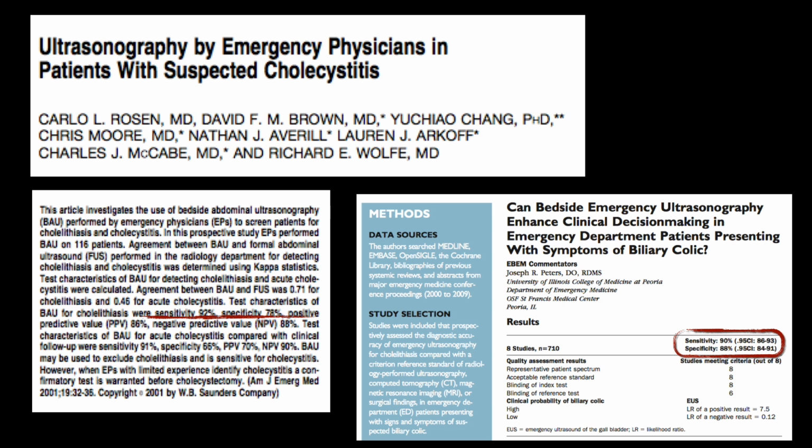And then in an ACEP review that was published many, many years later, there's an aggregate sensitivity of 90% and specificity of 88% for us doing bedside ultrasound, and this is looking for patients with symptomatic biliary colic. As we look at it, these numbers are starting to look very, very similar to the radiology numbers that we saw a couple slides ago. And so I think the justification here is ultrasound is good to find it to begin with. When you compare radiologists doing this with emergency physicians doing this, we're coming up with similar statistical outcomes.